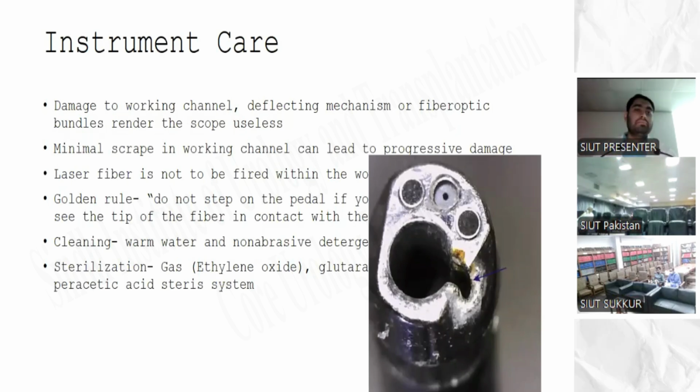How do I identify a ureteric orifice that you cannot see in the first place? What maneuvers, what procedures can you do? Anyone else? Right. Or we can inject a dye and wait for some time. It will come from the ureteric orifice if it is patent and draining the system. Can we change the lens? Okay. Changing the lens to 30 and 70 degrees also helps. Also, if the bladder is overfilled, the ureteric orifices might be displaced too laterally, or if it is underfilled, the mucosal folds will obscure the vision. Okay, so you're right. Now the last slide.